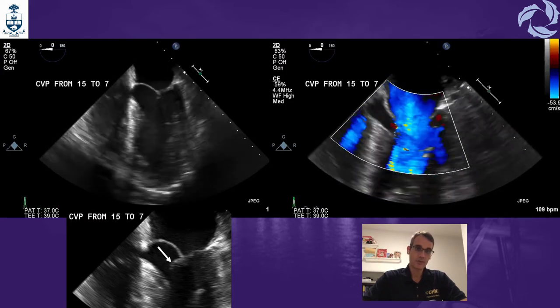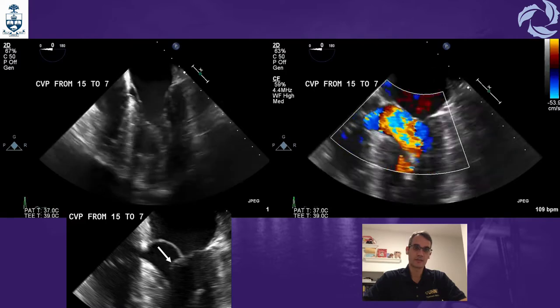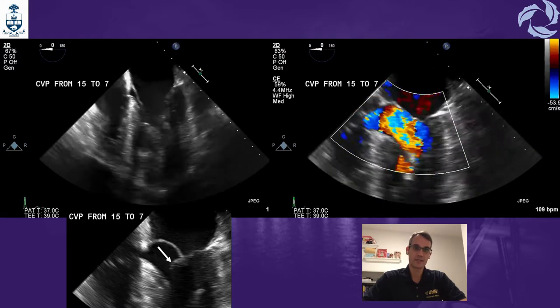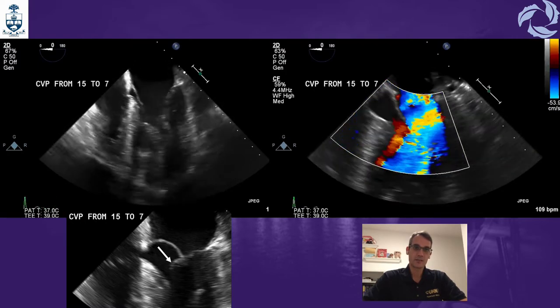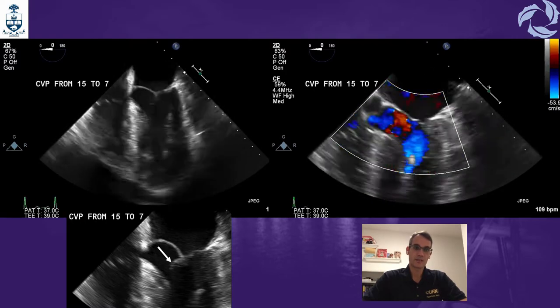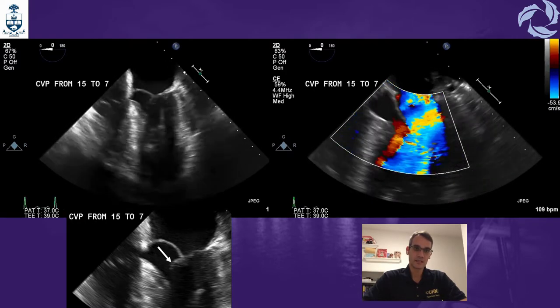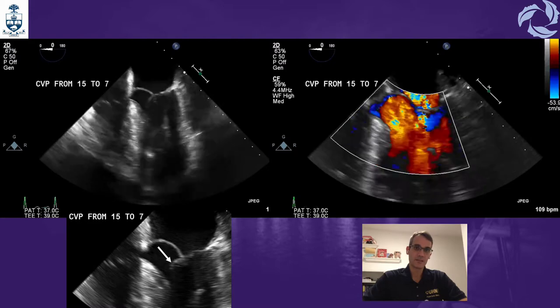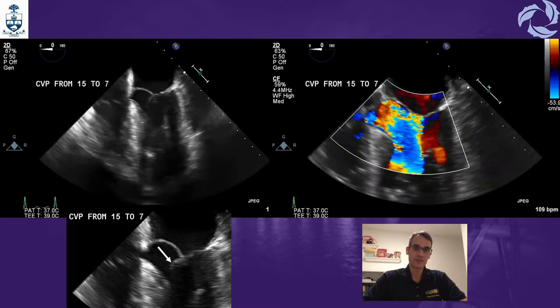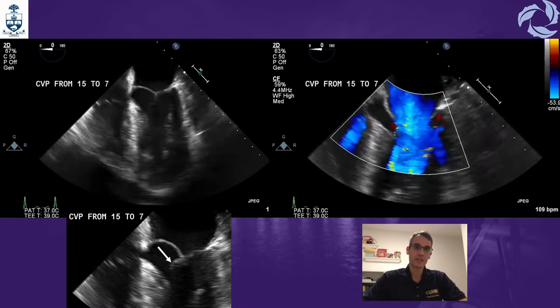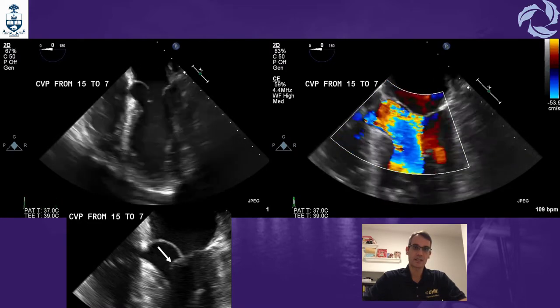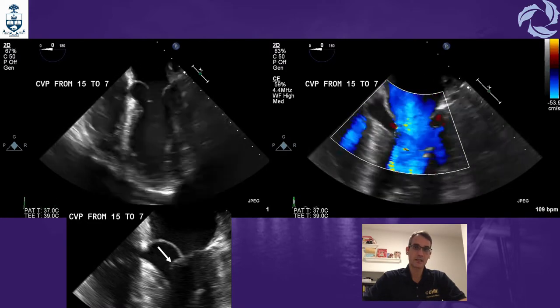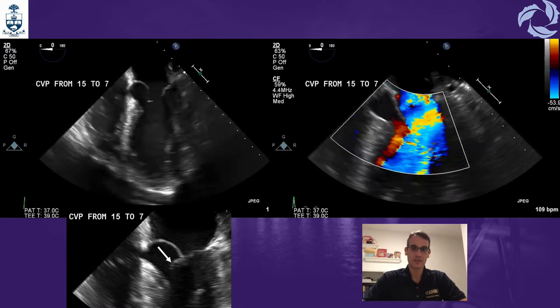The left ventricle was super thick, very empty, and very hyperdynamic. As you can see, we can again see SAM, flow acceleration in the LVOT, and mitral regurgitation.